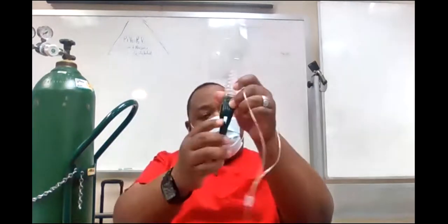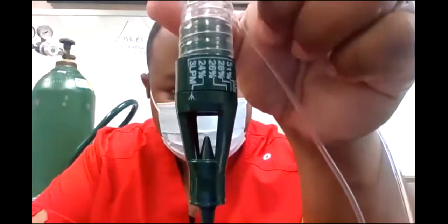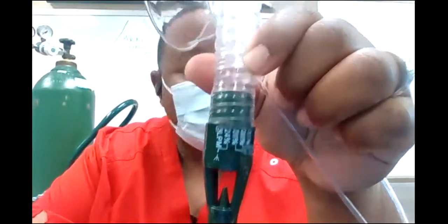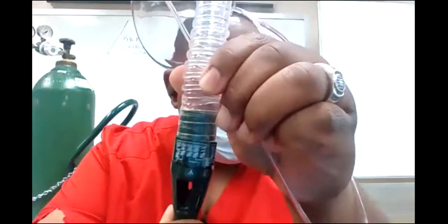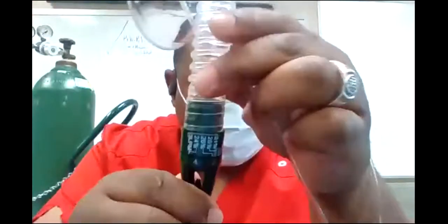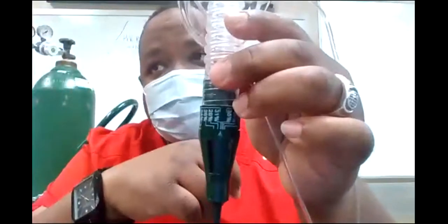But if I open that window up, so now I'm open, and my arrow is at what? What's my arrow showing? What percent FiO2 is that? No, that's 3 liters. Remember, that's a 24%. So they're letting you know if you want one of these FiO2s right here, you have to turn the flow on 3. Turn the flow on 3 and then turn this to which one of these you want, okay? And you'll get that FiO2, right? You've got to have the percentage and the liter flow, okay? And then if I want one of these FiO2s, then I have to turn it to one of these FiO2s and cut the flow to what? 6 liters on this, happen to be on this Venturi mask, okay?